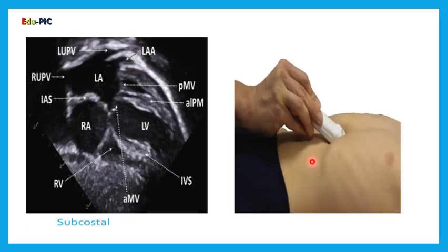When we rotate our probe clockwise from 12 o'clock to 3 o'clock, as we see the marker here towards the 3 o'clock and with slightly anterior angulation, then we can see the four-chamber subcostal view. So we have here the left atrium, right atrium, and interatrial septum.